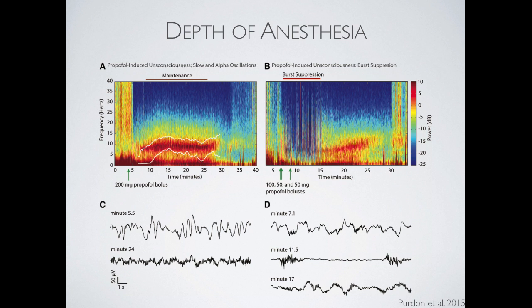Over here is a burst suppression mode. Now, anesthesia isn't my area of expertise, but by the time you get to this area, you're having brain activity that's basically interspersed by these what we'd call isoelectric points of zero activity, essentially. So this is an example of somebody going from consciousness to complete anesthesia to a drowsy state where they're still able to intermittently respond to stimulus. And all of this is easier to track by eye when you're looking at the spectrogram than the actual signals themselves, and also allows computers to do quantitative analyses that are a little more empirically principled than we would get from visual inspection.